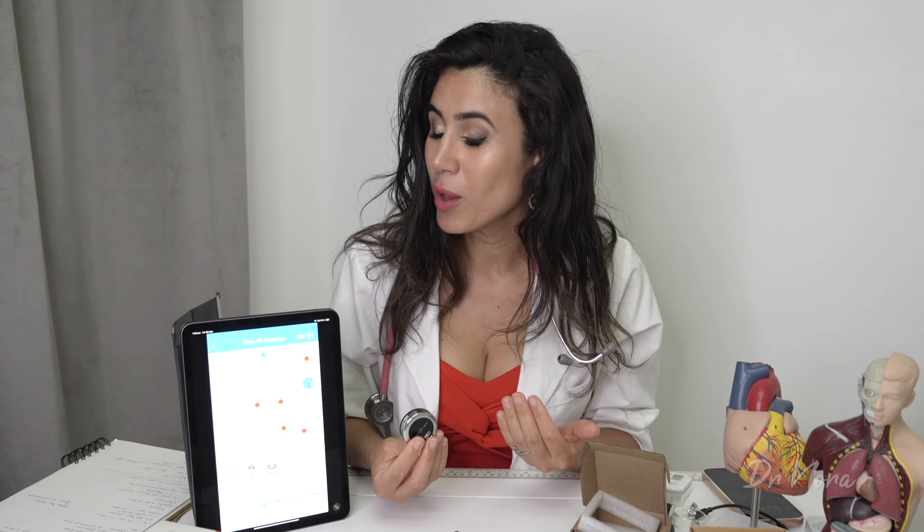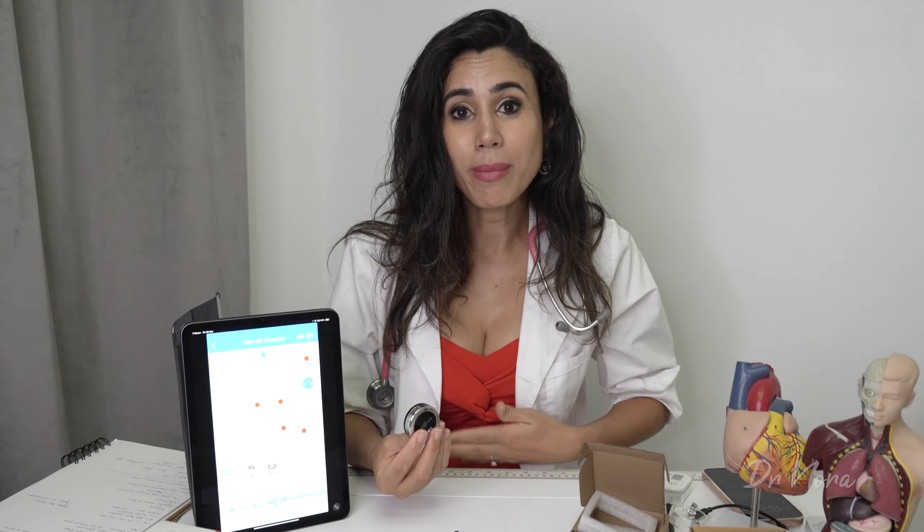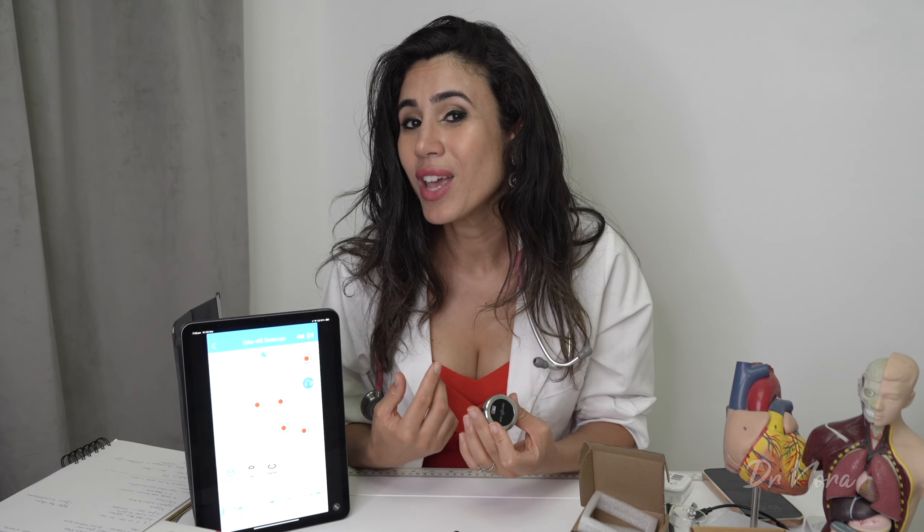Something to improve in the future: Stemoscope may want to add more listening areas to the app, such as the carotid arteries — useful for detecting bruits — or bowel sounds. Of course you can listen to bowel sounds without the app, but you should annotate it correctly, otherwise you might confuse a bowel sound for a lung sound.